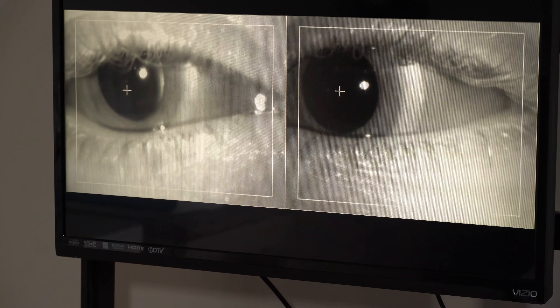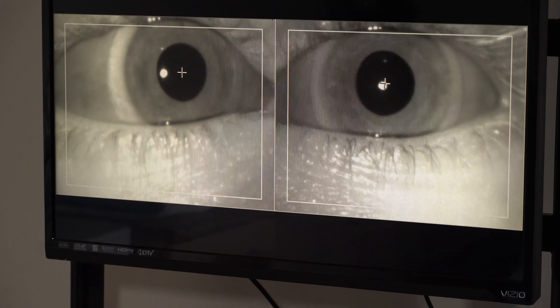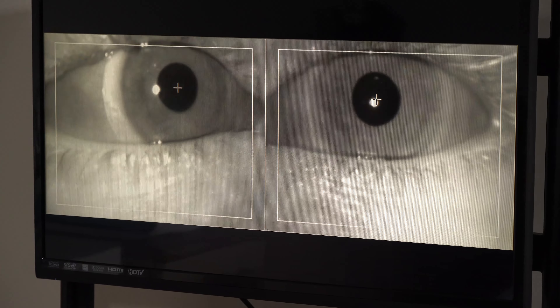Eyes open, keep them open — we keep measuring as it fades off. Go ahead and stare at the red light, try and make it hold still. The motion of the eyes reduces a lot when you have something to focus on, and that's also a good sign. That's what I do during the VNG test.